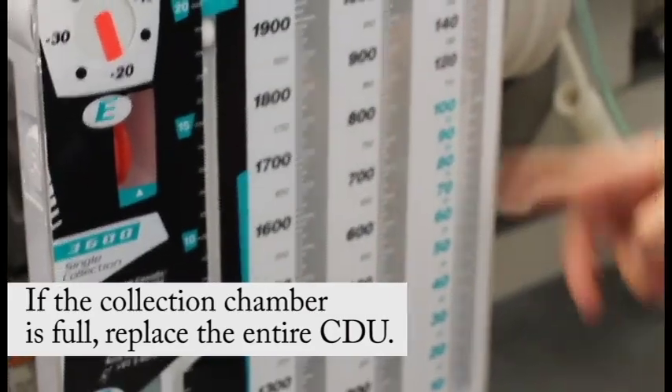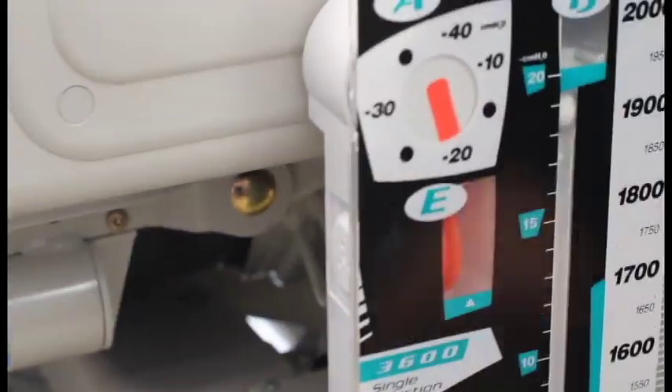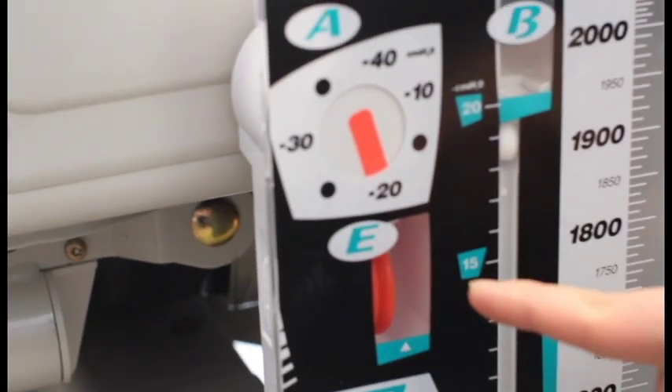Note the drainage color and amount in the collection chamber. Consider the rate of the drainage. Assess your suction control window to make sure the orange float is still there. If it's gone, you may need to turn up your suction.